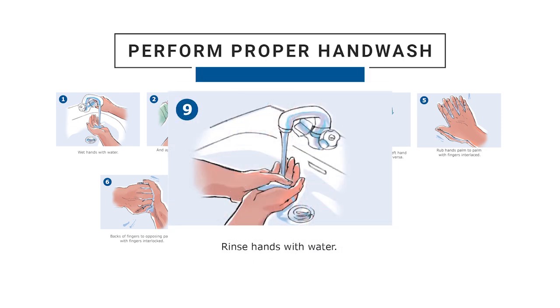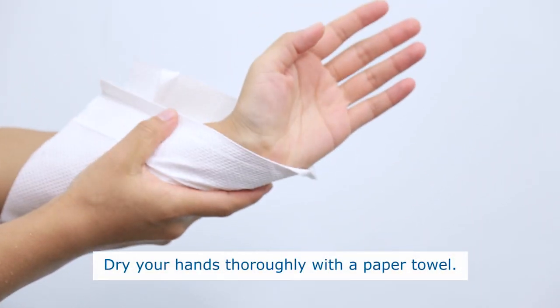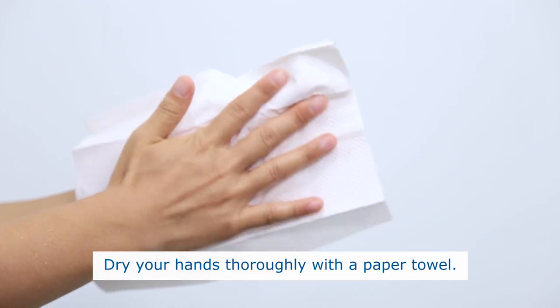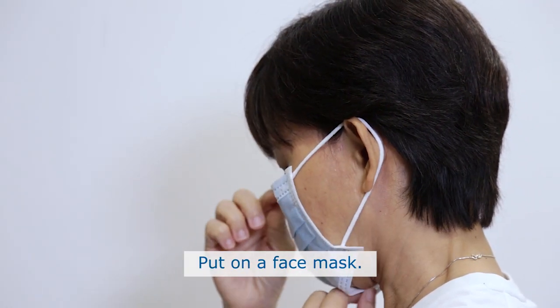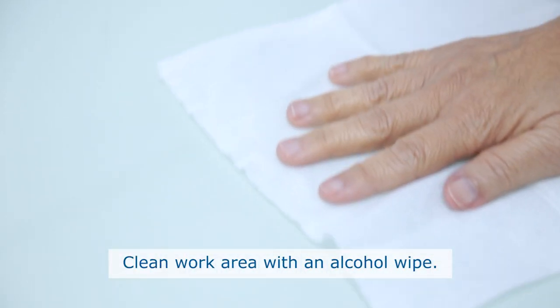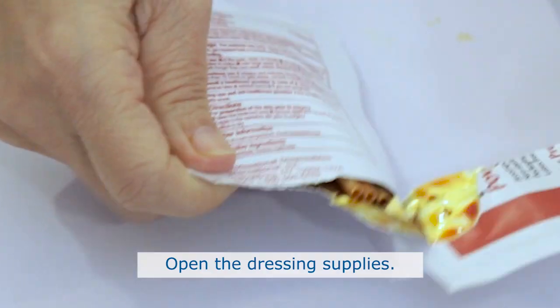Step 9: Rinse hands with water. Dry your hands thoroughly with a paper towel. Put on a face mask. Clean work area with an alcohol wipe. Open the dressing supplies.